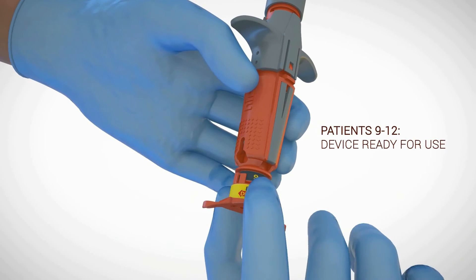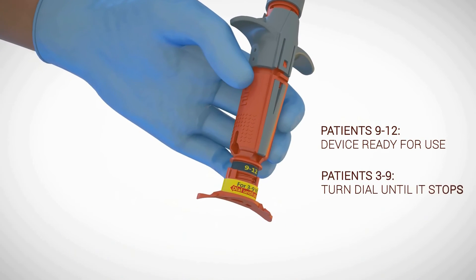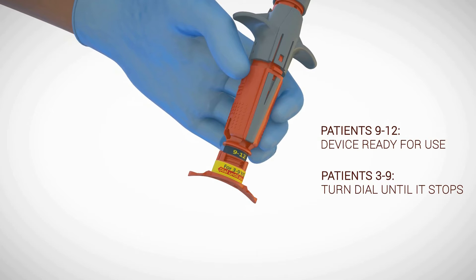To adjust to the correct needle penetration depth for patients ages 3 to 9 years old, turn the red needle stabilizer until it stops.